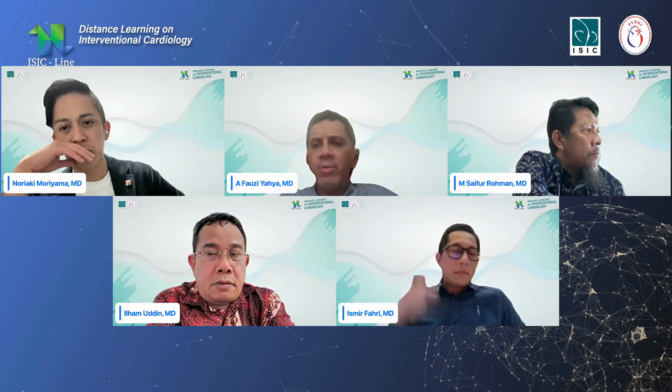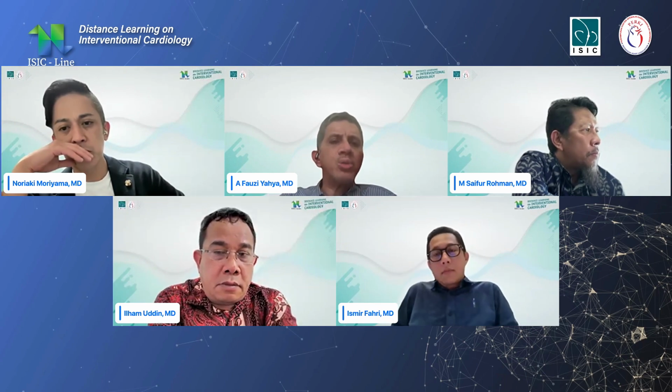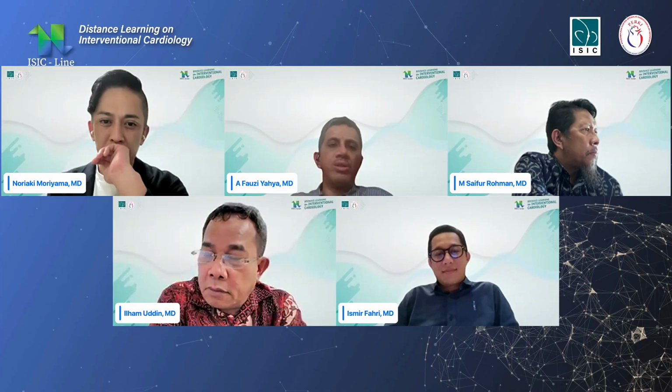Okay. And the other one is late catch-up thrombosis. Whether this is caused by excessive metal overhang. Because sometimes there is excessive metal overhang because of no kissing balloon, and then still overlying metal in the ostial side branch. Whether this causes the thrombosis?